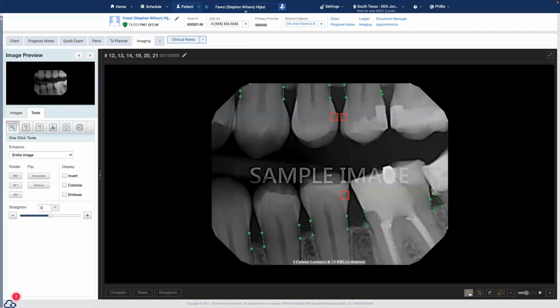Again, I'm not trying to do as many cavities as we can, but we can educate: look, the computer is picking up some weak spots. We may not choose to do this filling now, but you need to do better oral hygiene, for example. They're very, very receptive, and it has a big wow factor for the patients.